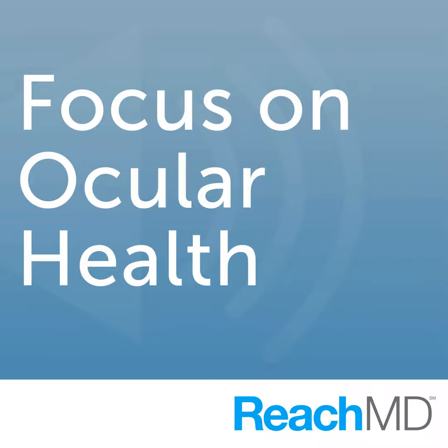Currently, the way the device works is we use a tiny little lightweight camera which is worn in the glasses, and you can't even tell that the patient is wearing this device. The camera picks up images in the environment and then sends this wirelessly to a chip that's implanted around or in the eye. This chip then receives this information, decodes it, and in accord with proprietary software which we've developed, ends up stimulating the nerve cells of the eye and sends the information to the brain. So effectively, you're taking somebody who's blind and hooking them up to a camera to be able to see.